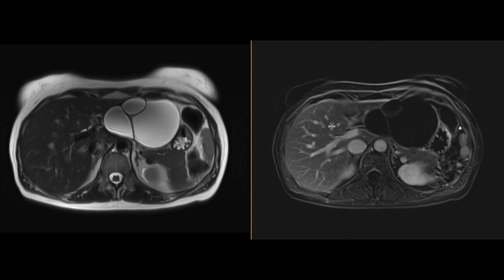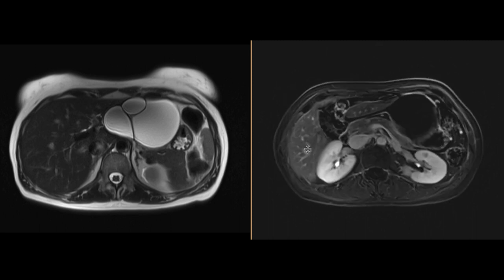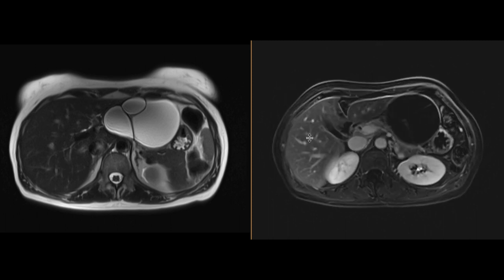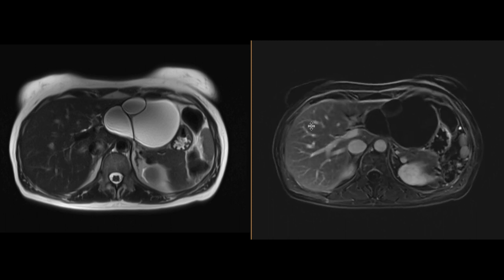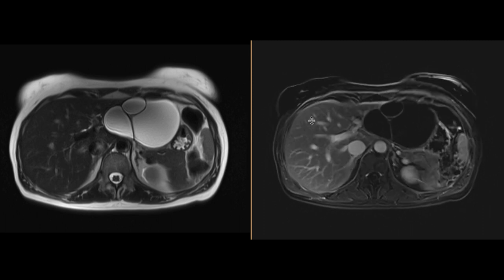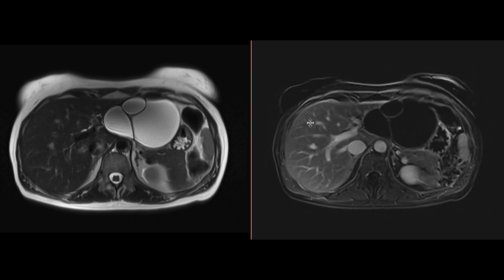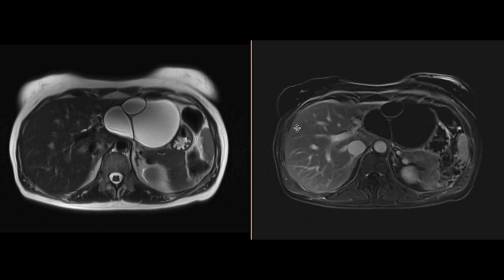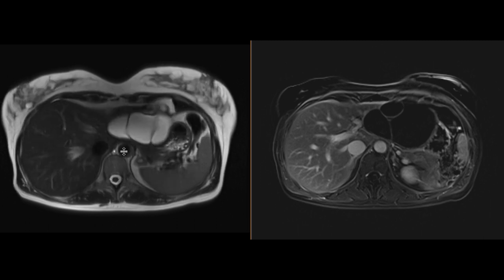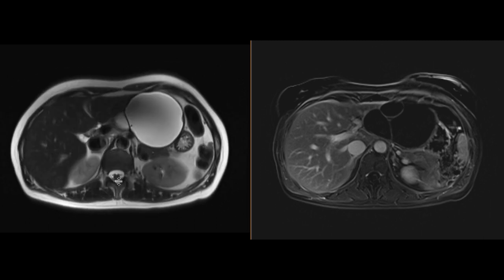This was formerly known as biliary cystadenoma, and they tend to look like this. They can be unilocular, but they often do have complexity with these septations. There is a predilection for the left hepatic lobe, and they tend to occur in females aged anywhere from 45 to 65 years old. They tend to be solitary, and we notice there's no other masses in the liver in this instance.